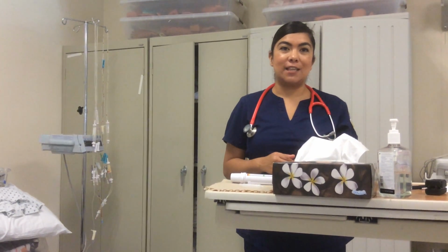Okay, so that is the proper way on how to administer and use a small volume nebulizer.